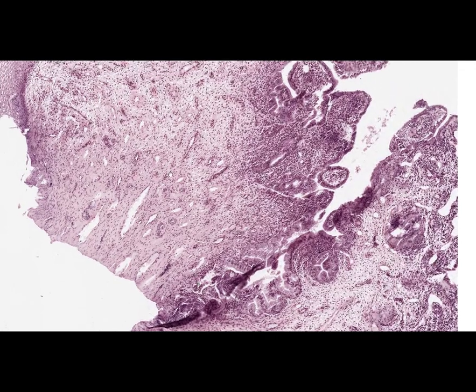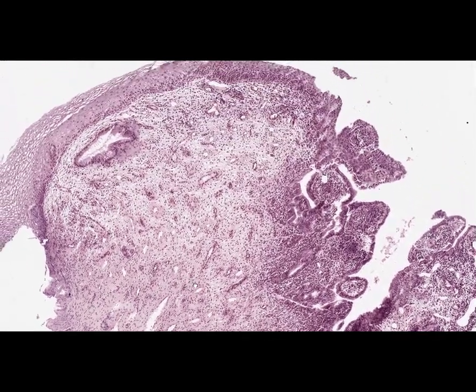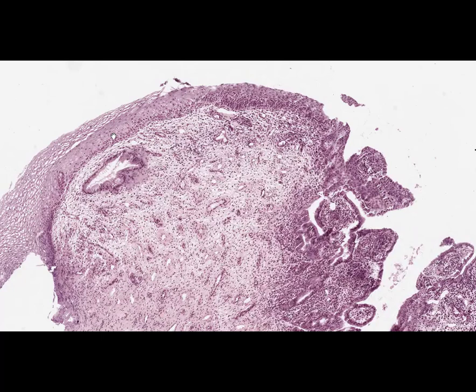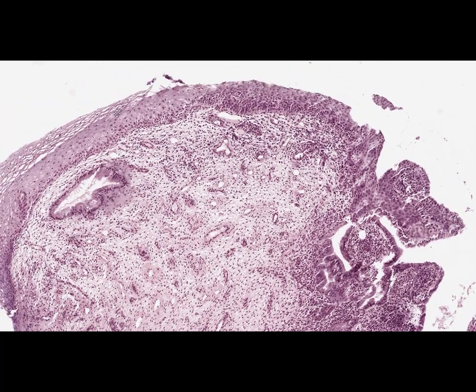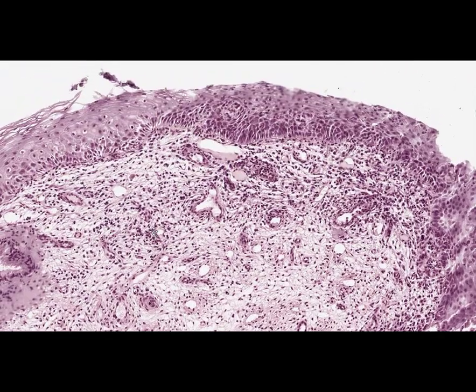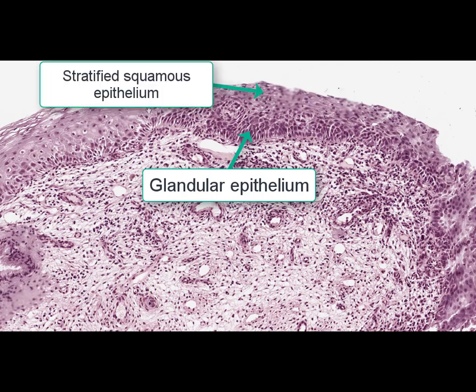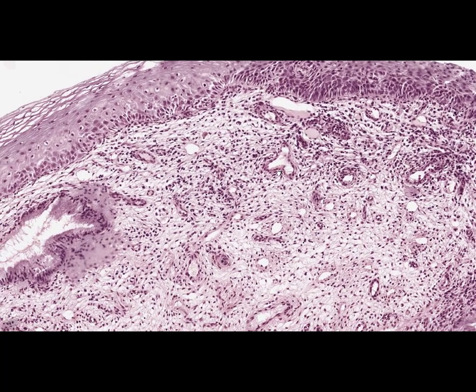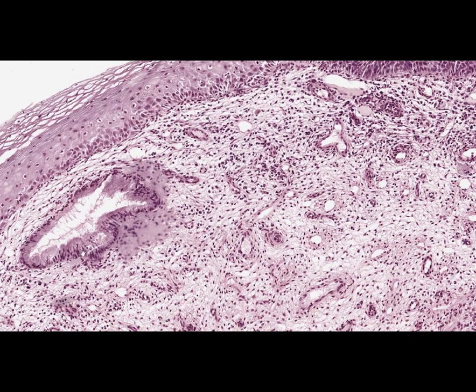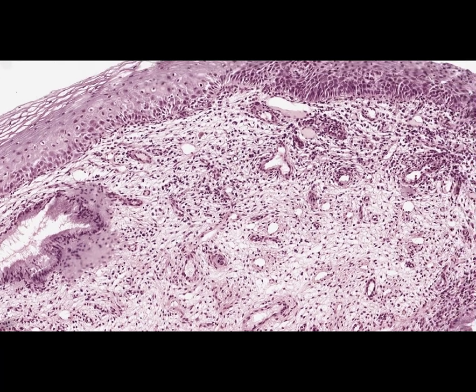At endocervicosis, the changes occur on the outer surface of the uterine cervix, where stratified epithelium is replaced by glandular epithelium. At higher magnification, changes in epithelial lining are found at the site of healing endocervicosis. Due to the healing process, the stratified epithelium grows over the healing site, while some glandular epithelium still remains under the growing new epithelial lining. Cystic expansion of glands, called nabothian cysts, is found in the submucous layer, which is typical for the healing stage.